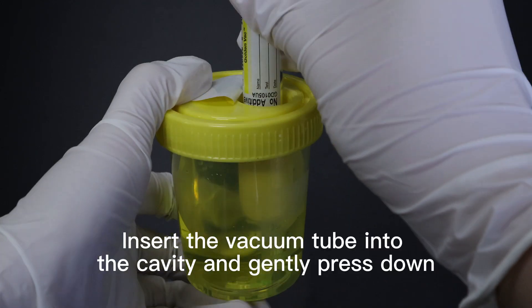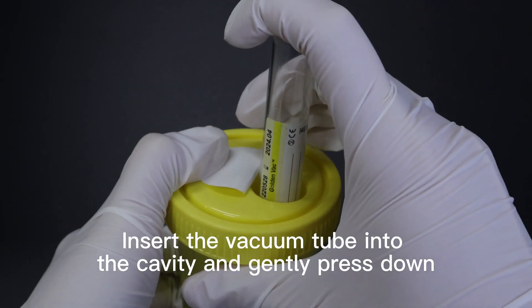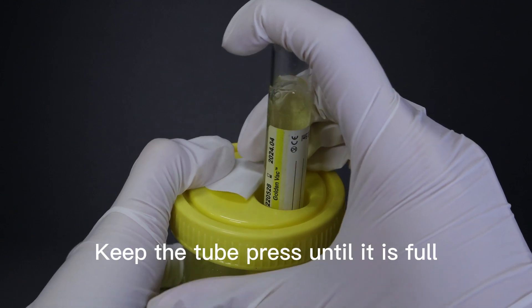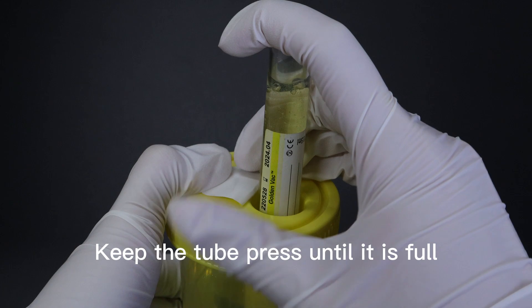Insert the vacuum tube into the cavity and gently press down. The needle will puncture into the tube. Keep the tube pressed until it is full.